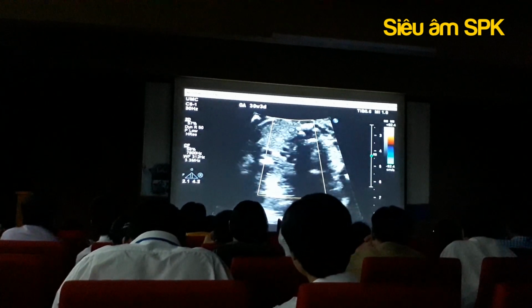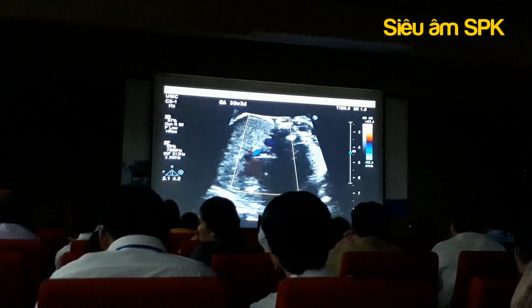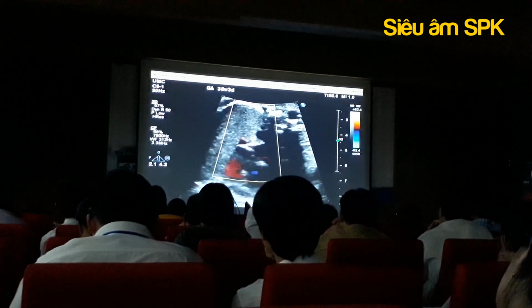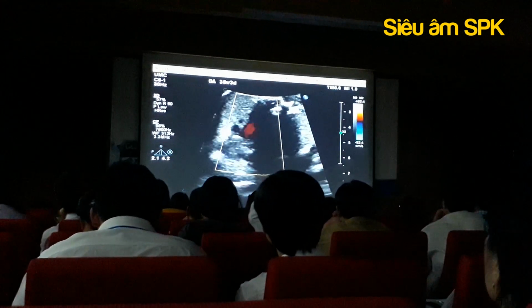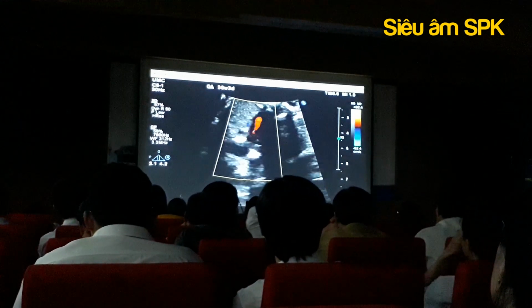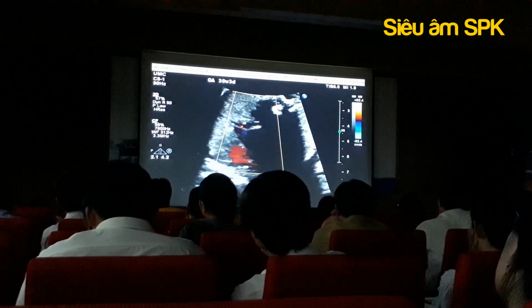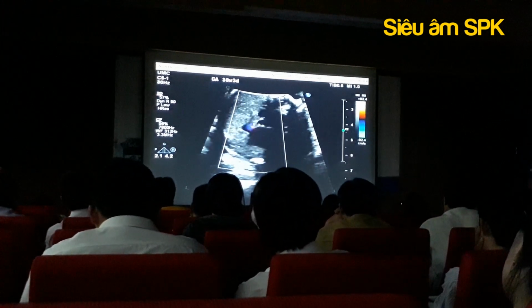With the right aortic arch, it is most likely coming from the underside of the aorta, so maybe that's it there. That's it. So this is the ductal, the aortic arch in red. And as I scan caudal, you see something blue. It could be coming from it. So keep your eye on this.